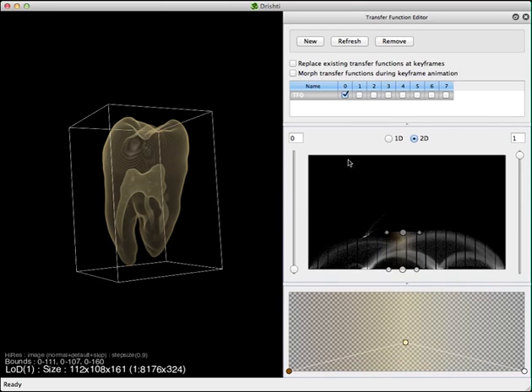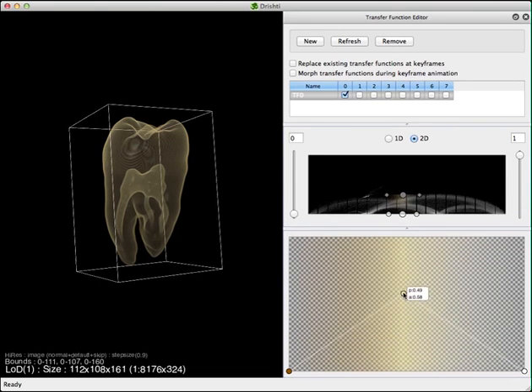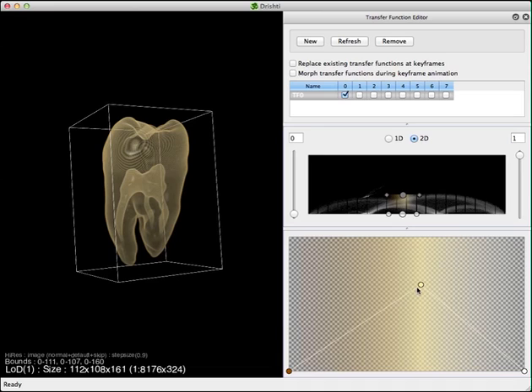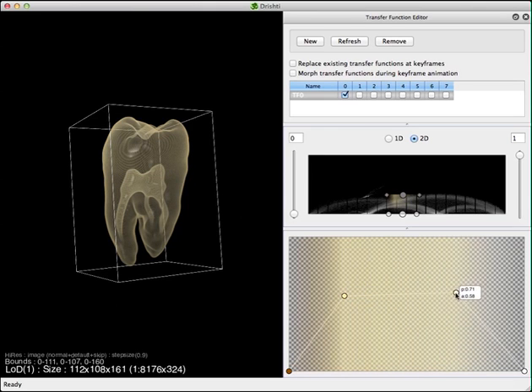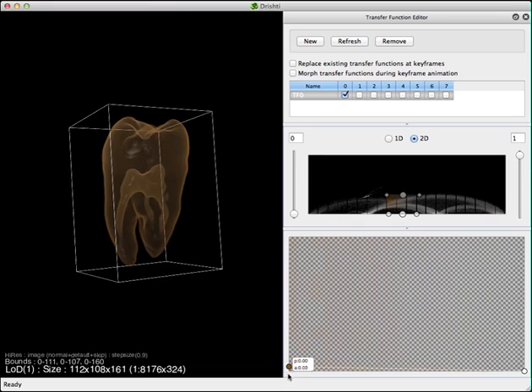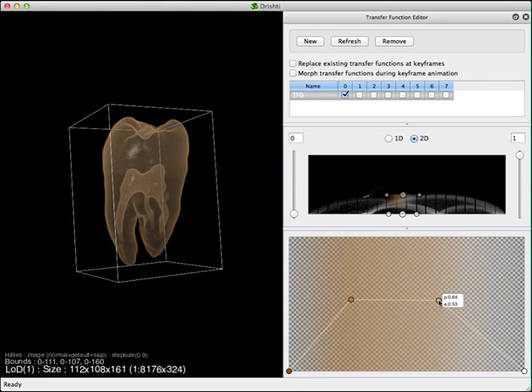Now let's look at the color-opacity interface. Use left mouse click to add a point — the point added will always have a color in between the two neighboring points you clicked on. If you click close to one end point, the color will be closer to that end point's color. You can add a color and then change the opacity. Left-click to add a color, right-click to remove the point. You can remove all points except for the two end points.